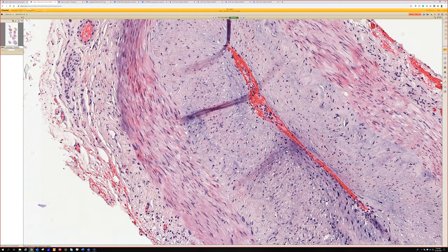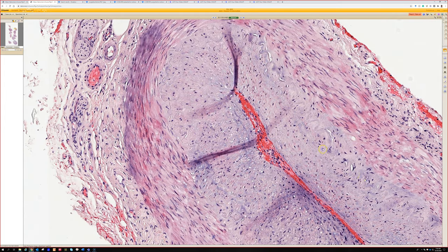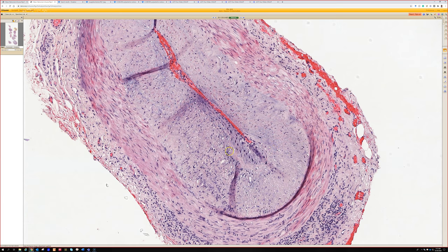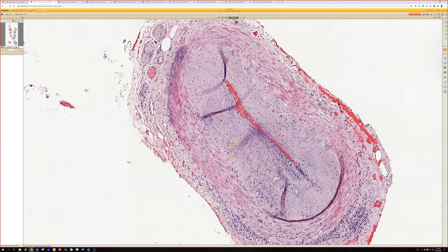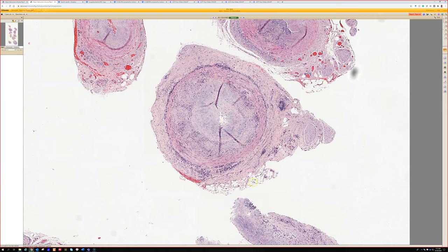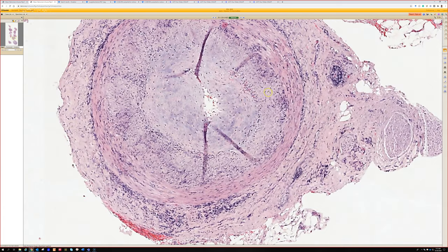We know we're dealing with an artery here because of the lamina. Even without the arteritis, this is not a normal artery. The intima — the part on the inside towards the lumen side of the elastic lamina — is super thick. It's really thick and has this kind of myxoid change. This is intimal hyperplasia, which probably means the patient has long-standing hypertension — a reactive thickening of the intima.